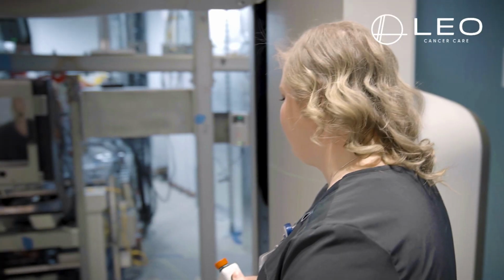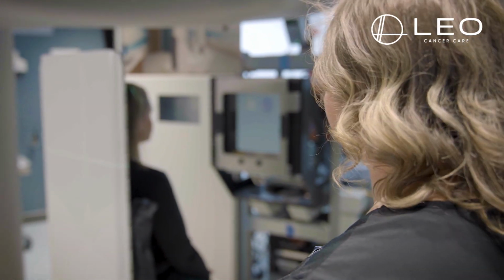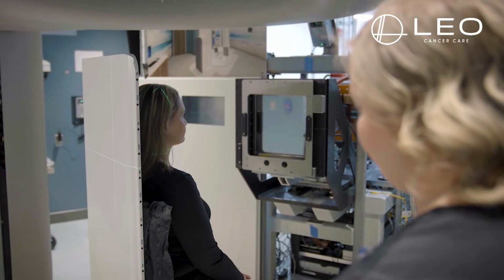But what's next for Leo Cancer Care? This is the first step in the journey to be a more human way to deliver radiation therapy. Proton therapy is coming this year. This is not a 5-year horizon. Leo Cancer Care will be treating patients with protons in 2025, but that's not where we're stopping.